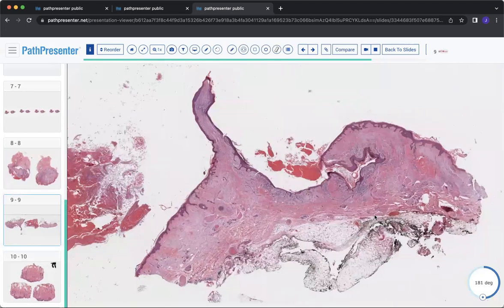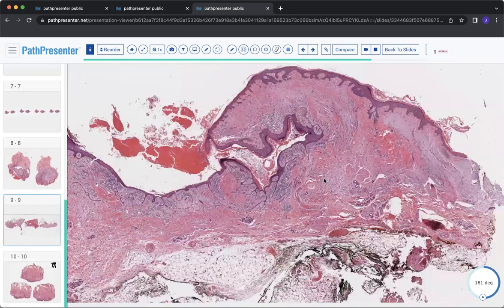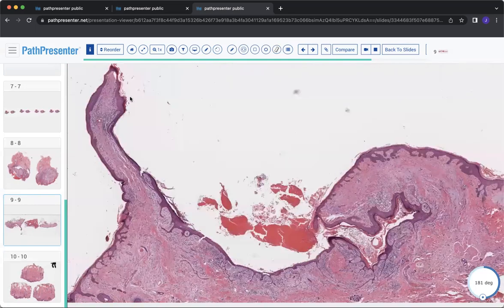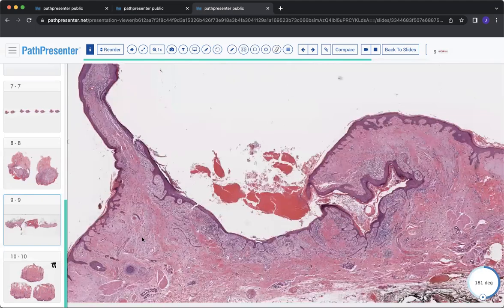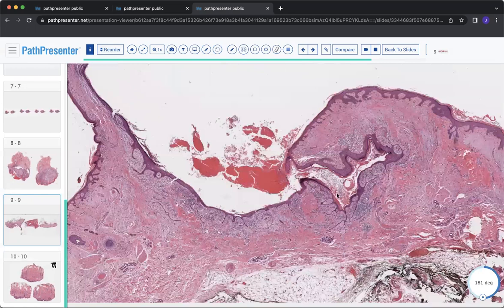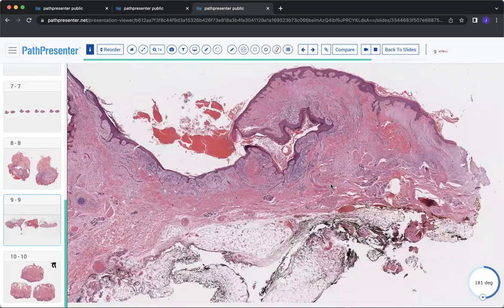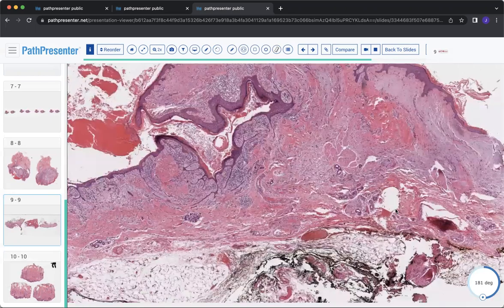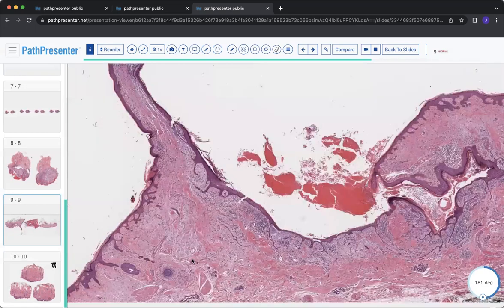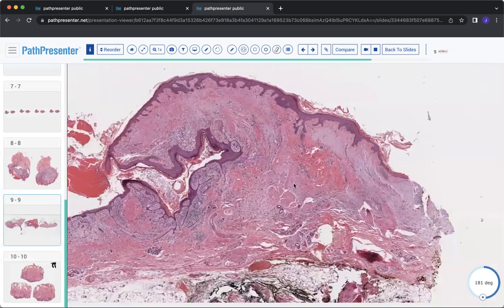So in this specimen, you may be asking yourself, well, I don't really know. This doesn't look like an adnexal tumor to me. This looks like some dermis, maybe this weird kind of architecture where you have this projection of tissue and then it kind of comes back down and folds in on itself and curves around. And it's kind of got this nondescript architecture. It's kind of hard to say, was it a pedunculated lesion or is it just sectioned weird? This is indeed an adnexal tumor.